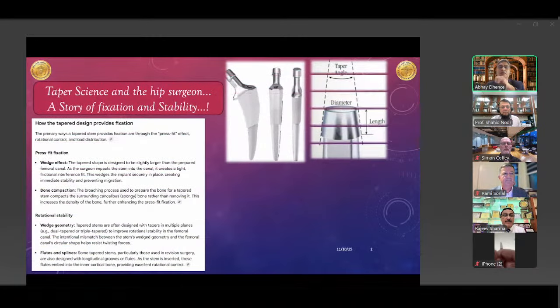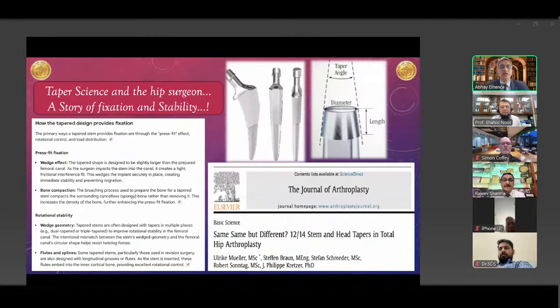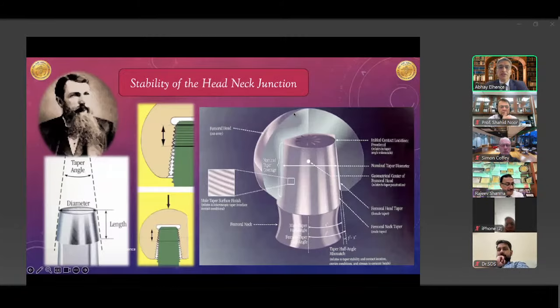Why do you want to talk about it, and why is it important? So essentially, it's a story of managing fixation well on the femur and providing enough stability for the stem to osteointegrate into where you have put it, so that we have appropriate restoration of our offsets.